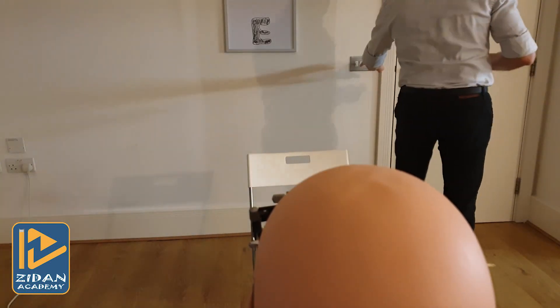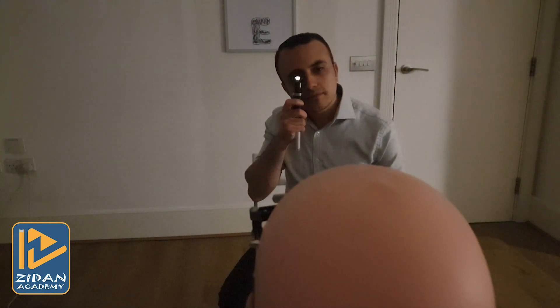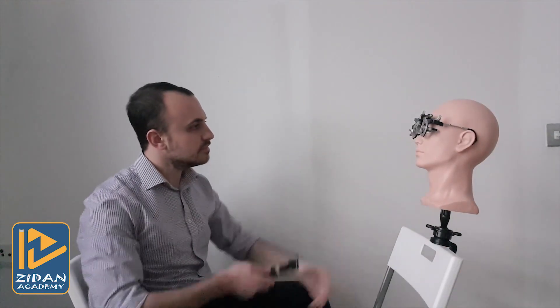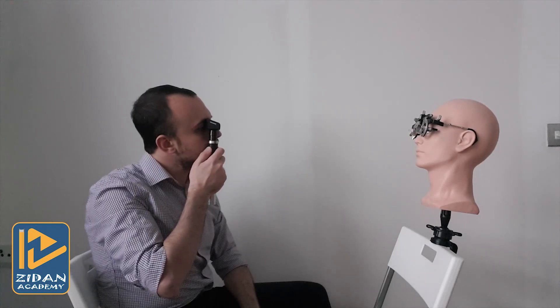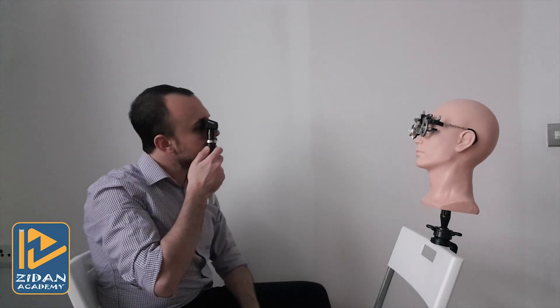First, you need to dim room light — this will help you to see the red reflex better and help you to maximize pupil size of your patient. You need to set an average distance of 66 centimeters away from your patient, which is approximately an arm's length. This distance is called working distance, and we will speak about it in detail later in this course.